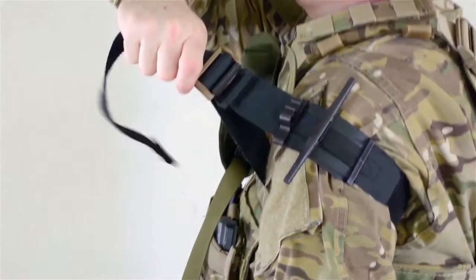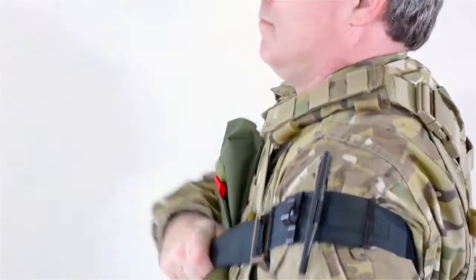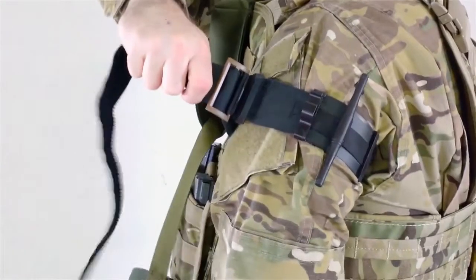Firmly pull up, out, and away from the body and then downward in a quick ratcheting motion. Repeat this step until snug around the extremity.